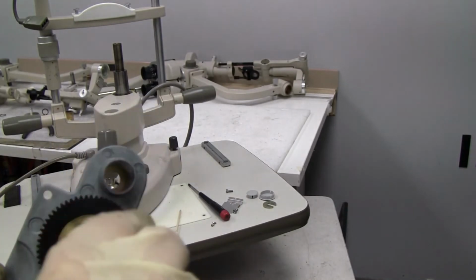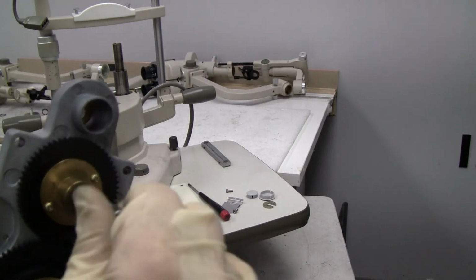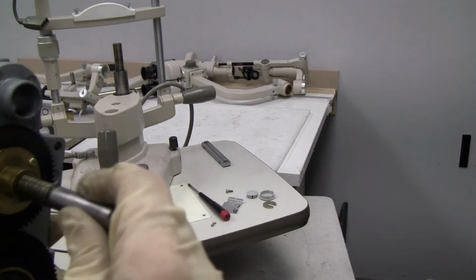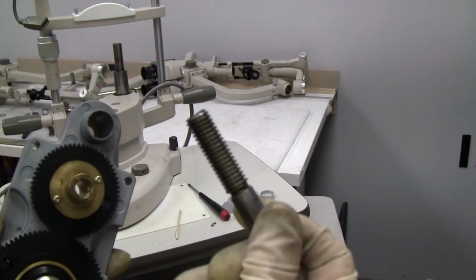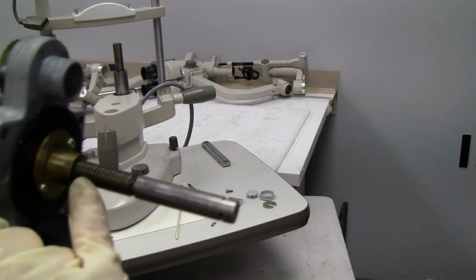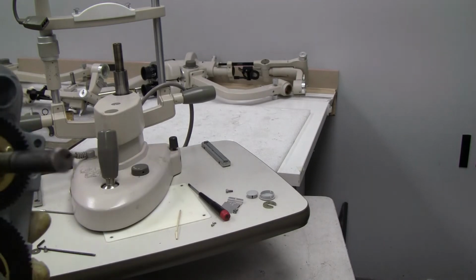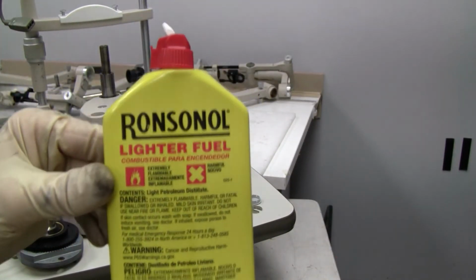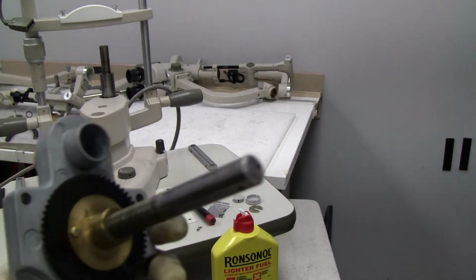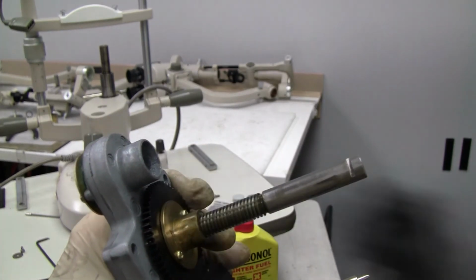And if your joystick has been sluggish, it's probably because the grease inside these threads has gotten old and bad. You need to clean all that old grease off. And sometimes this grease is so caked in there and old that it is not that easy to get off. I soak it. You can soak it in something like this, something that'll break down that grease. You might need to get a little brush while you're soaking it to clean those threads.